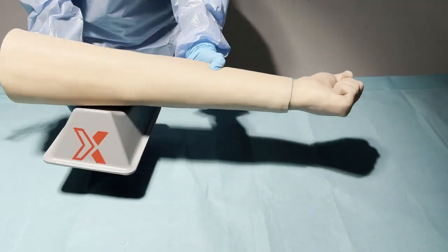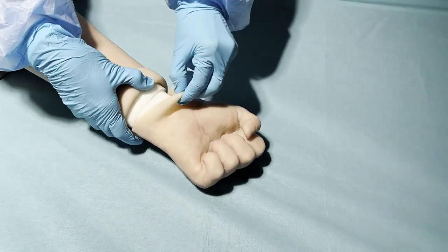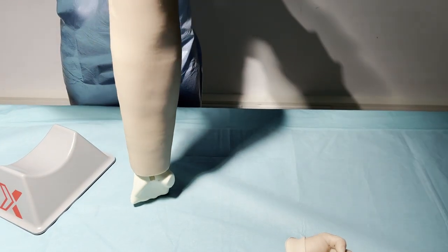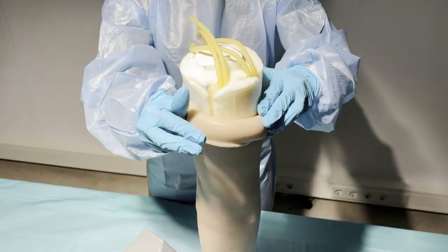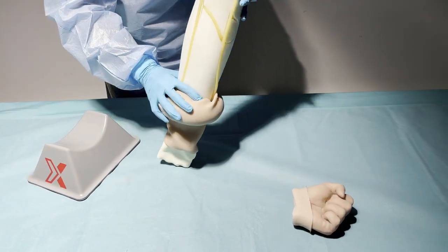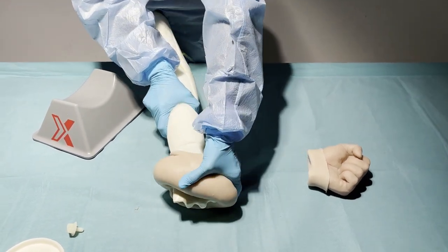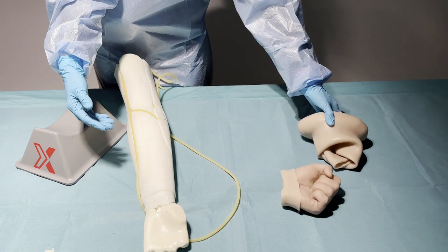Now we have to remove the hand skin by rolling the skin from the wrist. And now we can start rolling the arm skin from the bicep and up to the wrist. The arm skin is made from a flexible material, so try to stretch and roll and remove it. The arm skin is removed.